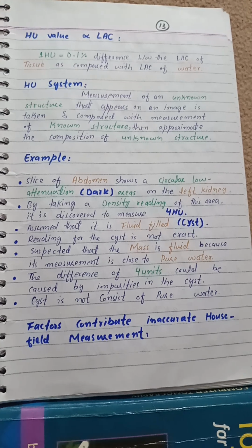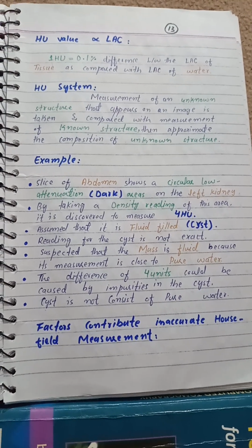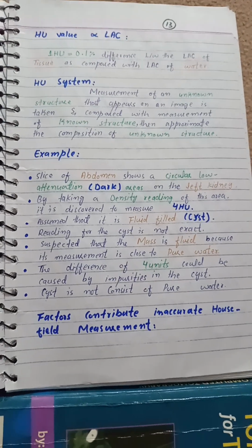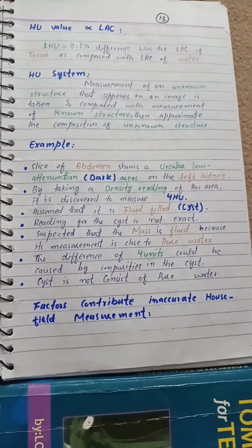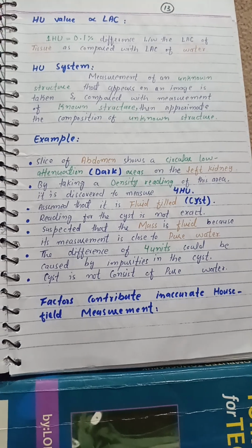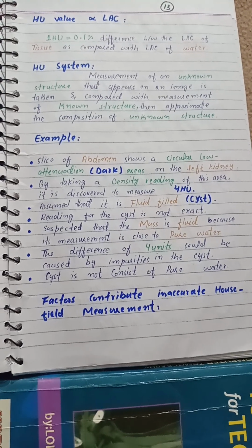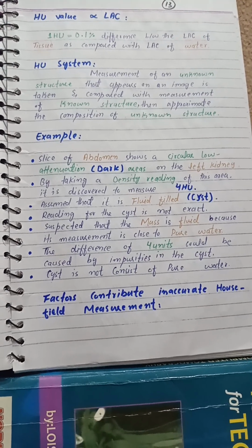One Hounsfield unit is equal to 0.1% difference between the linear attenuation coefficient of tissue as compared with the linear attenuation coefficient of water. Hounsfield unit system: measurements of an unknown structure that appears on an image is taken and compared with measurements of known structures, then the composition of the unknown structure is approximated.